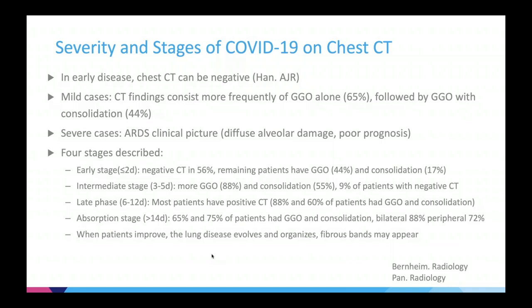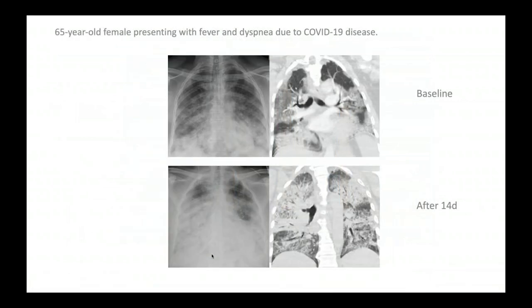Here is an example of a 65-year-old female who presented with respiratory symptoms. At initial presentation, you can see some patchy bilateral areas of opacity on the chest x-ray, with corresponding ground glass opacity and consolidation on the chest CT. After two weeks, the patient's condition worsened, and this is almost like an ARDS-type picture where patients generally require mechanical ventilation.